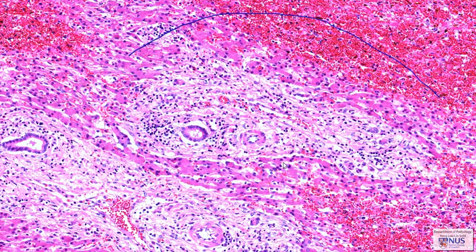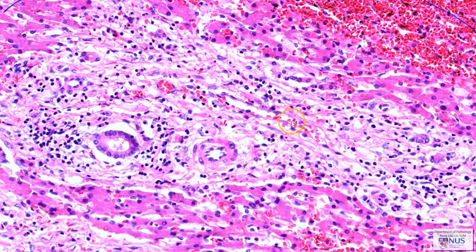Let me move to an area where we can see a portal tract, and here we can see part of the bile duct, the artery, and it's quite difficult to appreciate here, but this is the branch of the portal vein. So we have the triad of the hepatic artery, the bile duct, and the portal vein branch within the portal tract.